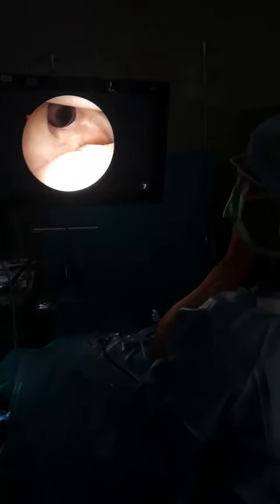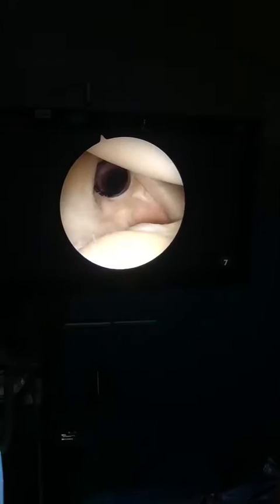Alright guys, we're here with a right shoulder arthroscopic surgery. We're just going to do a quick drive through the shoulder and go over some of the anatomy here. So you can see this is the glenoid here on the bottom and the humeral head here. You can see it's rounded.